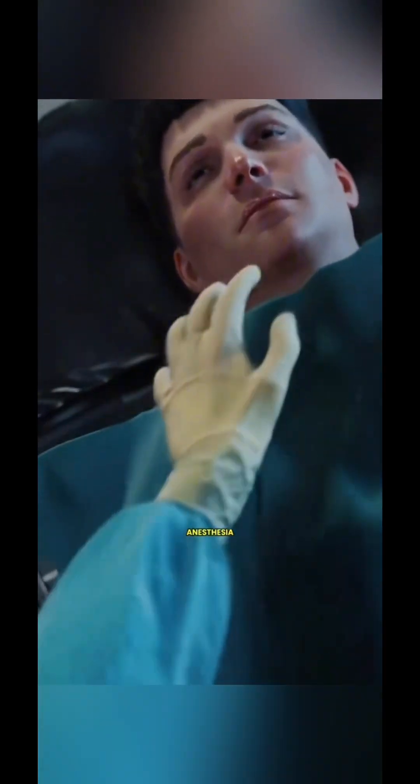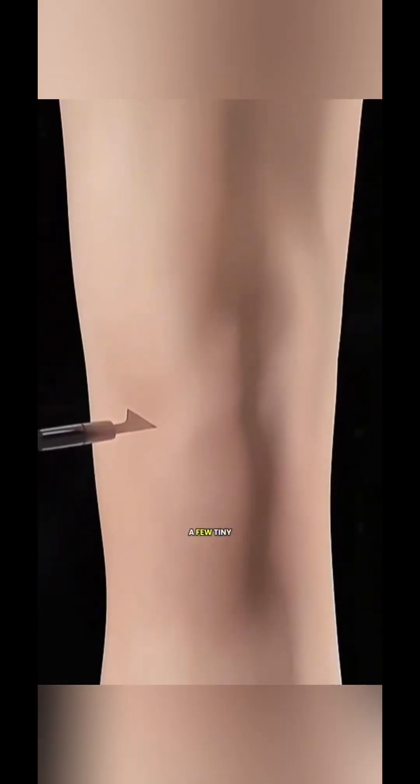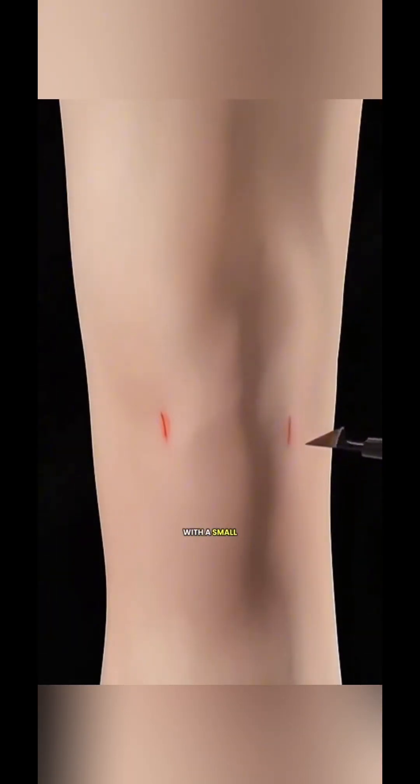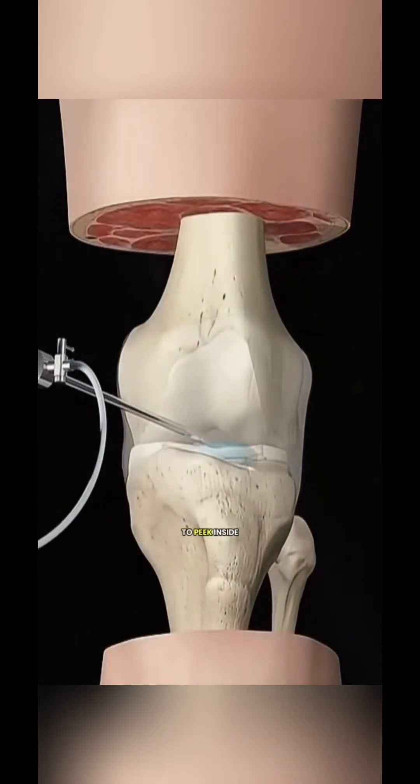It starts with anesthesia, putting you into a deep sleep so you don't feel a thing. The surgeon makes a few tiny cuts around your knee and gently inserts a slim tool with a small camera — an arthroscope — kind of like using a mini submarine to peek inside.